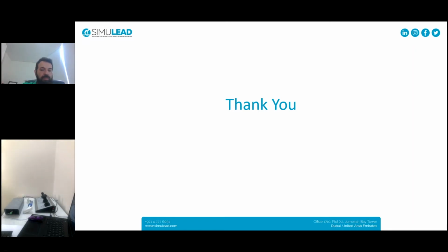The system will still work. The hardware is yours, but the modules will expire. The reason is that I'm an educator and I wouldn't like to repeat the cases over years and years. Students will be talking about them and will guess the cases easily. So there is a trend for advanced trainings to change the cases every now and then. But you could still own the cases forever. And if you have a basic training, not an examination or testing level training, you could keep the cases.